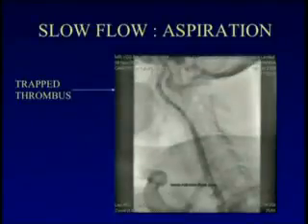And then we saw that while we did this, even in that time, we trapped thrombus in the filter. And we were lucky that we had the filter, because the thromboembolism happened after we had put the filter. After we did this, we did an aspiration and cleaned that area up, and then took out the filter.